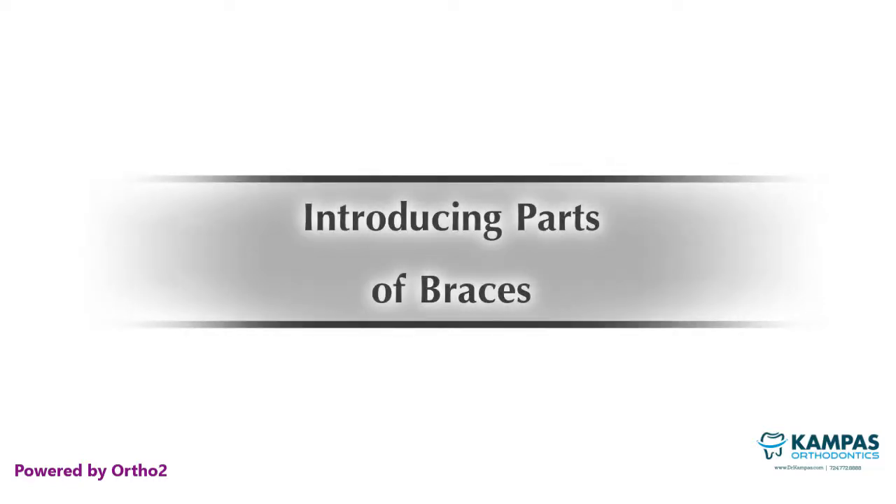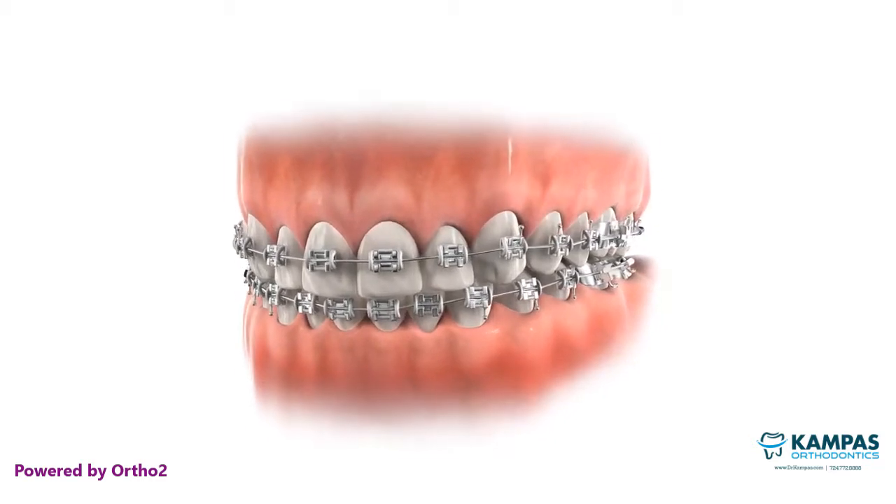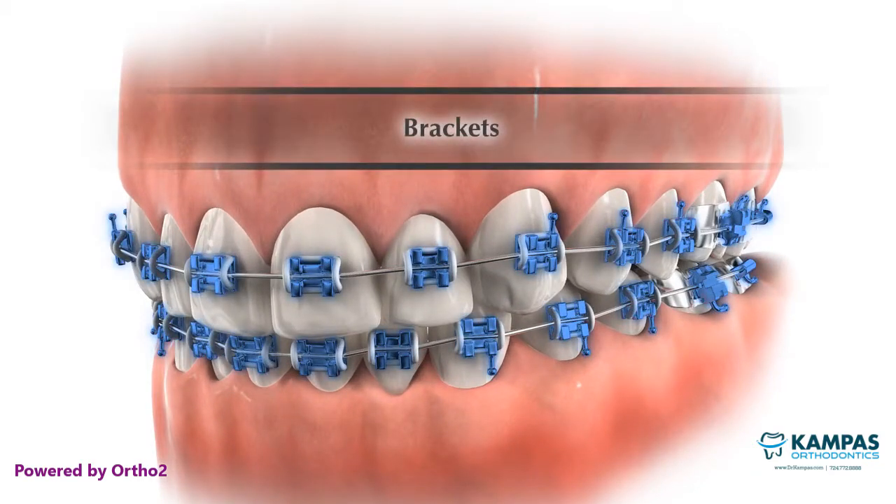This short video will introduce you to the four parts of your orthodontic appliance. The bracket is a metal device that is bonded to the teeth and acts as a handle.